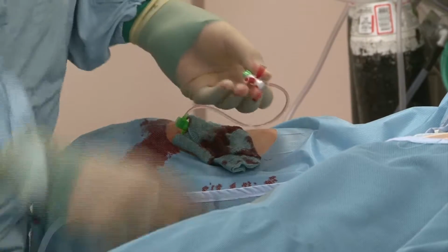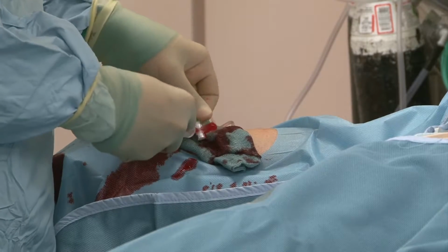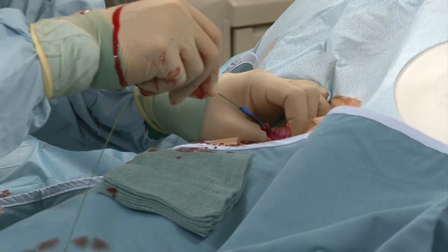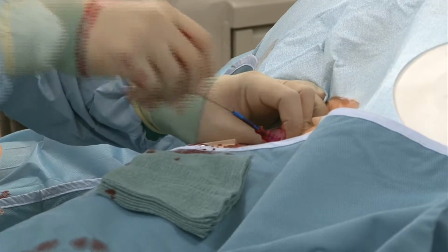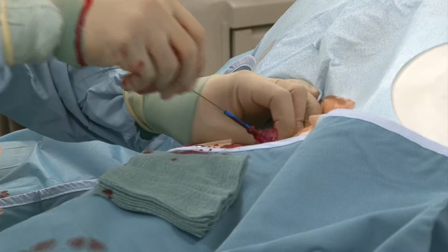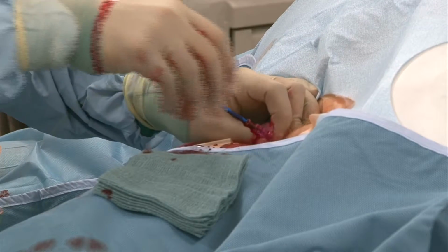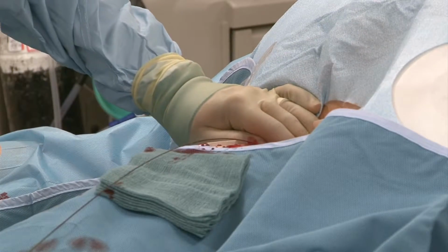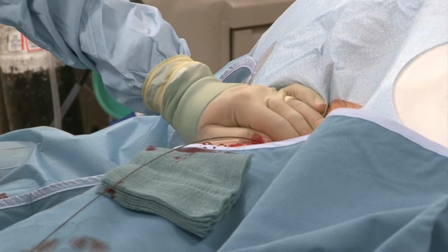In treating a chronic total occlusion, it's usually needed to insert two sheaths, one to provide access to the blocked artery and the other to access the other artery which feeds the blocked territory backwards through small communicating vessels called collaterals. Here we see both a radial sheath and a second sheath being inserted into the femoral artery, which is the artery at the top of the patient's right leg.